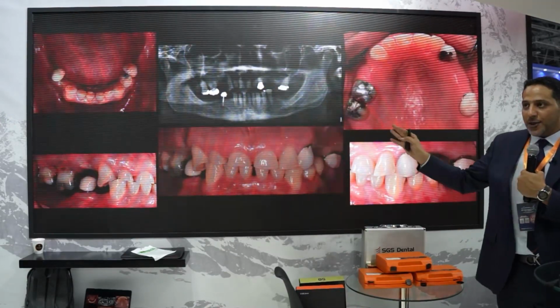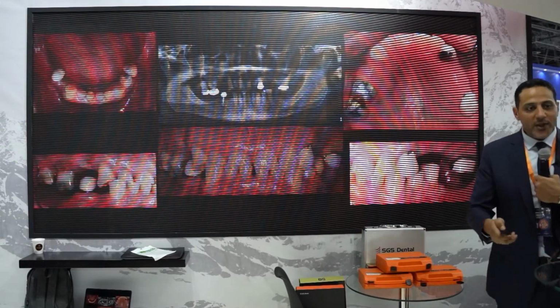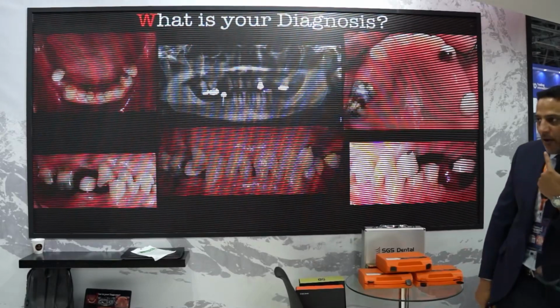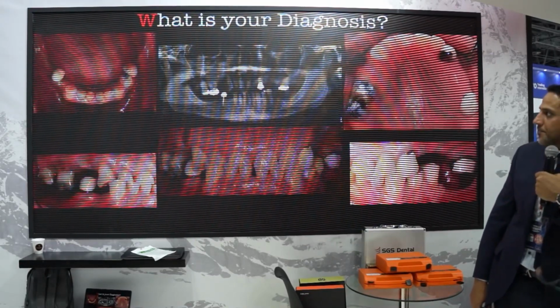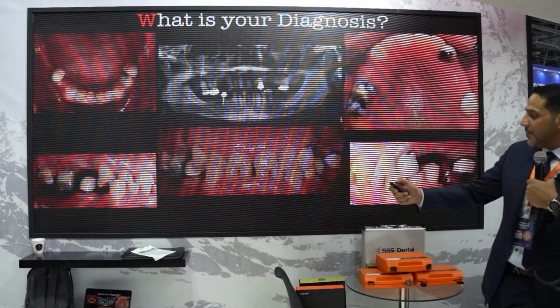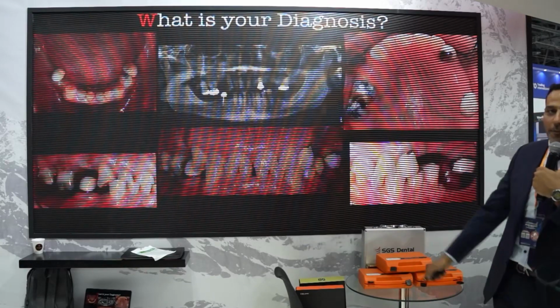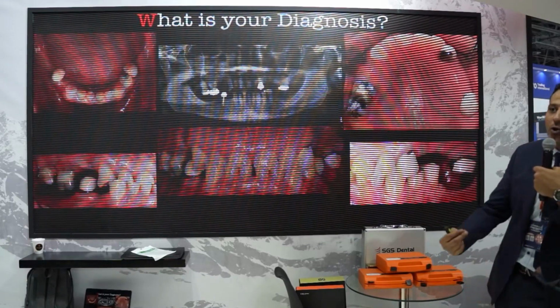So if we look at this case, I ask you, what is your diagnosis? This is the mandible, maxilla, right and left, and the frontal view with the OPG. It's enough to give a diagnosis. What is your diagnosis here?